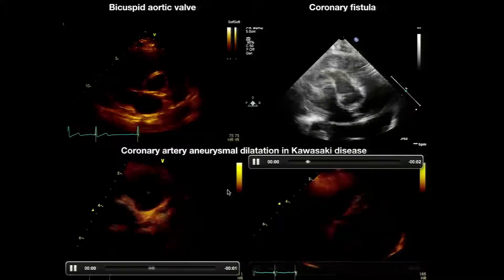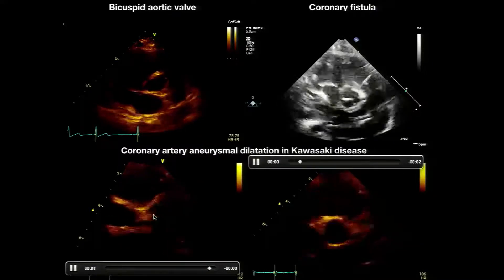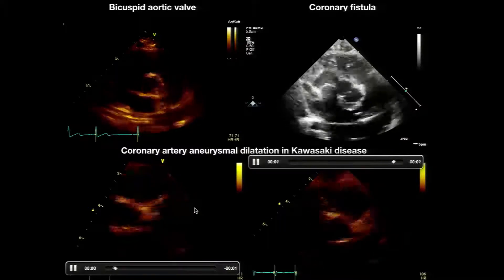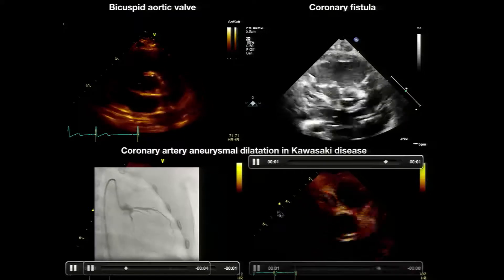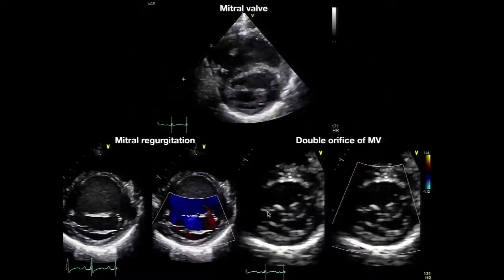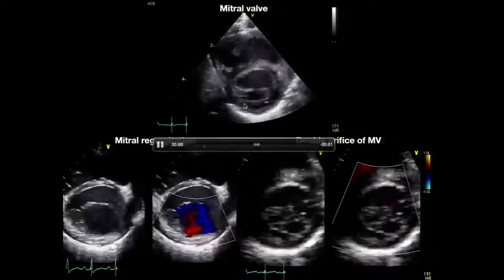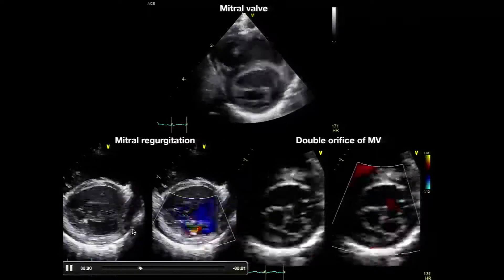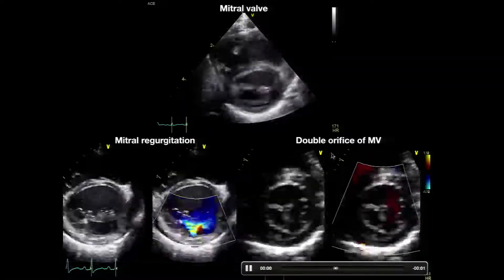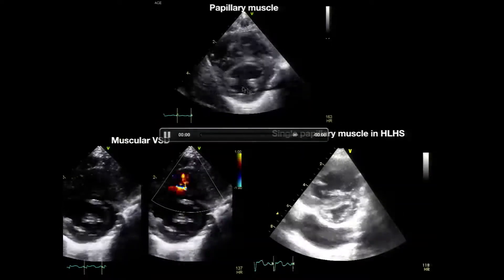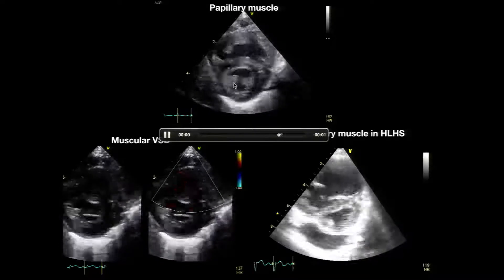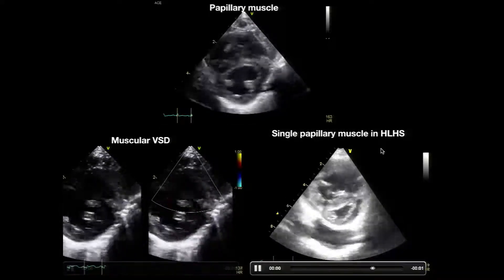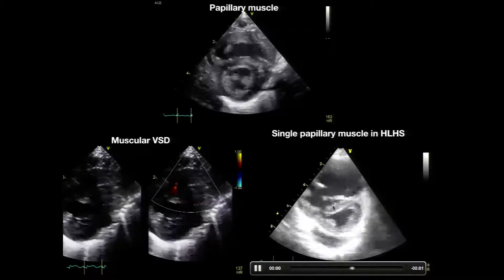In Kawasaki disease you evaluate the coronary arteries; this patient shows coronary dilatation in both left and right coronary arteries, and echo correlated well with the angiogram in the cath lab. The mitral valve view shows severe mitral regurgitation, thinning of the ventricular wall, and poor ventricular function. Two orifices indicate a double orifice mitral valve. Sweeping apically shows the papillary muscles — a muscular VSD can be seen here, and in a hypoplastic left heart or parachute mitral valve patient, a single papillary muscle may be seen.